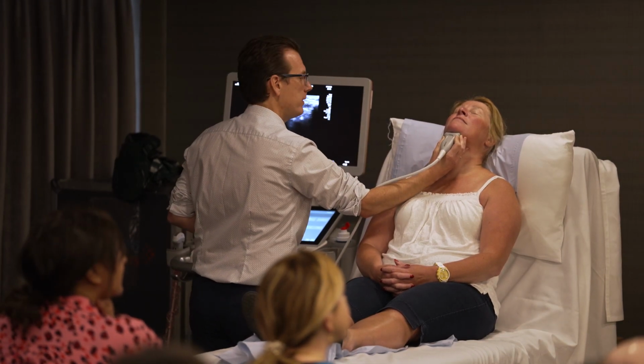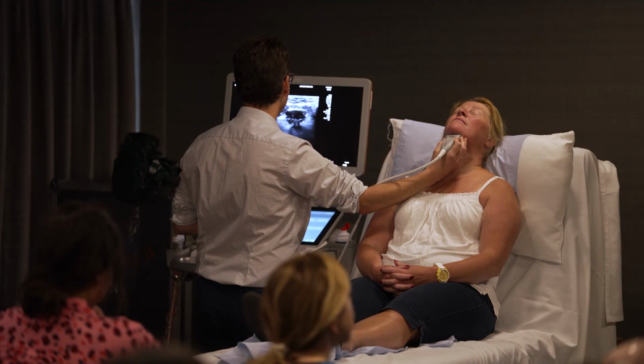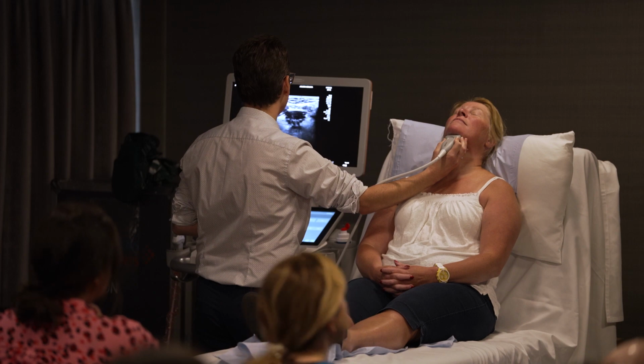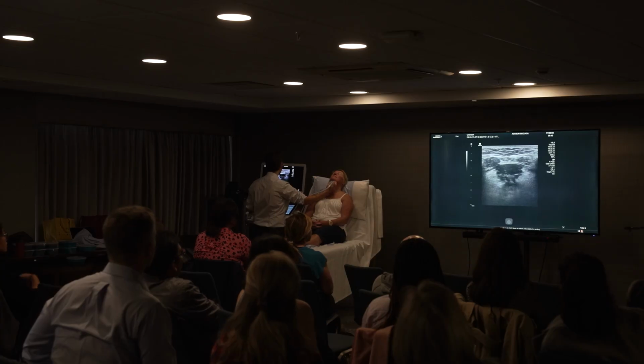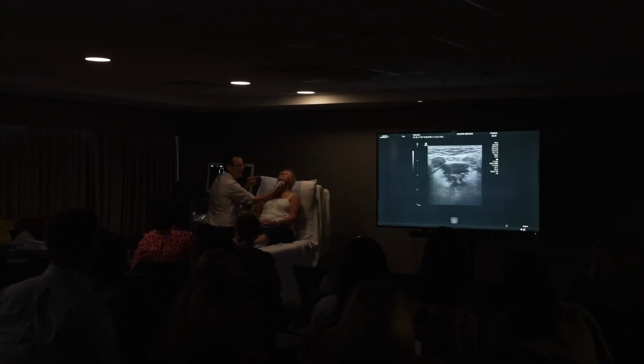So scroll back through level 1. As you can see, the mylohyoid muscle, geniohyoid, genioglossus. As you come back, has this got an arrow on it? No. Vina, you're right to just point to the screen, just like that.